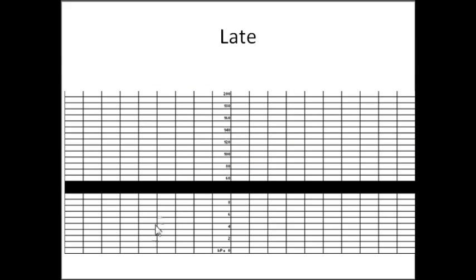So we have a late deceleration. We're going to see a uterine contraction and a uterine contraction. For a late deceleration, our baseline is going to be 140, 140, 140.